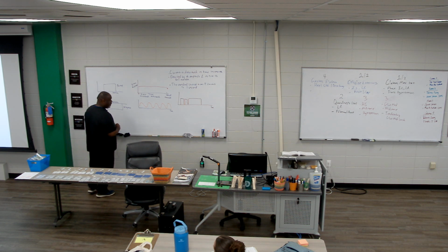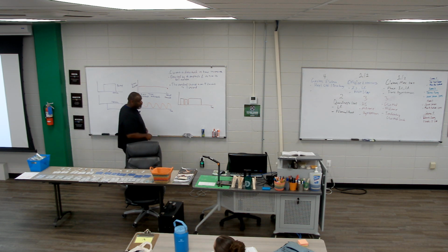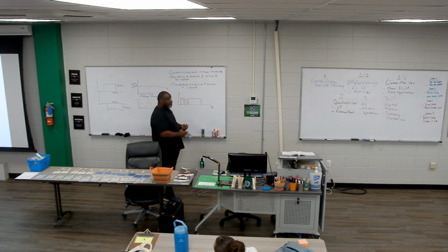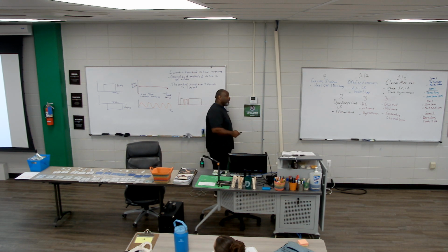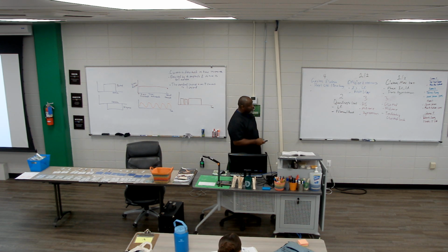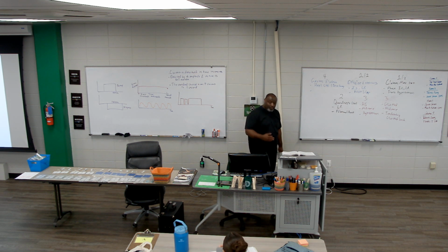So it could be positive or negative, but it's unidirectional, similar to DC, but the main difference between it and DC is it's going to interrupt. It's going to end before this 1 second interval. So somewhere in there, it's going to end before the 1 second interval.